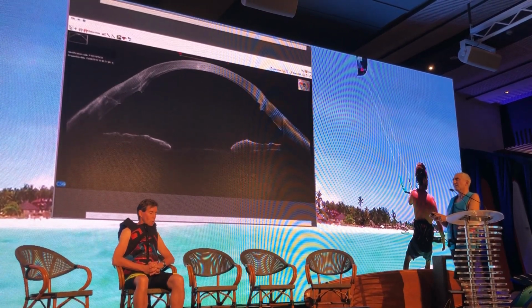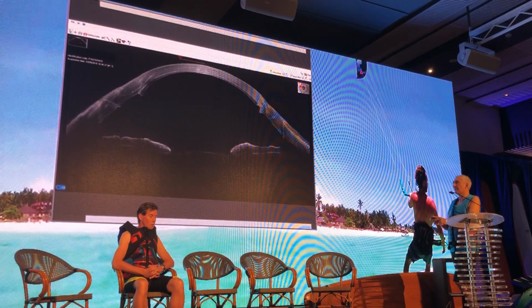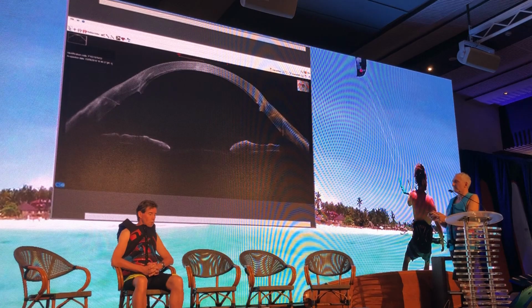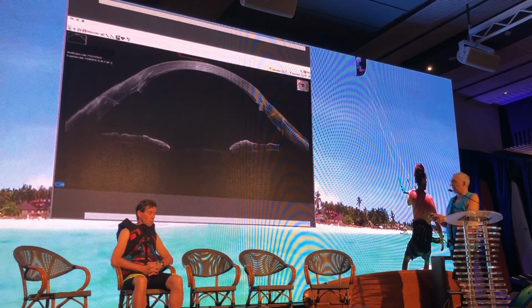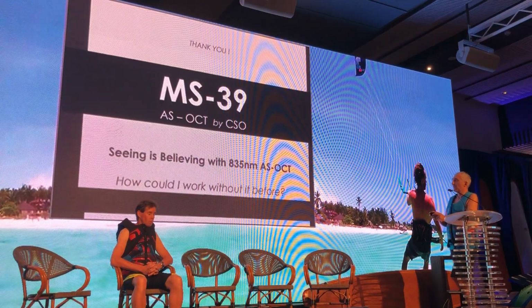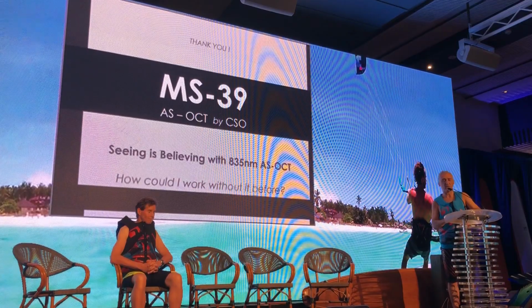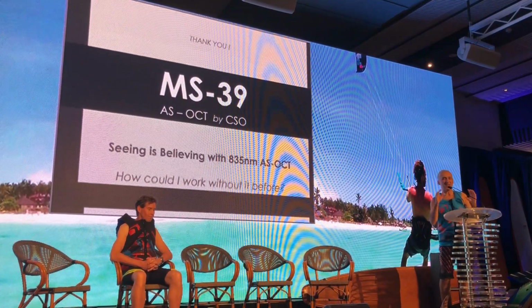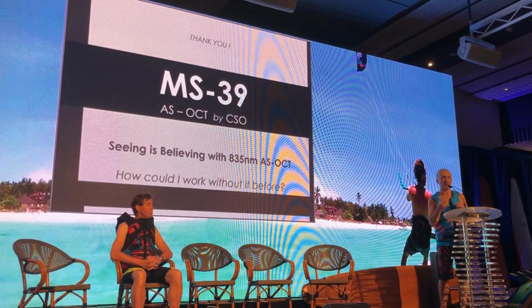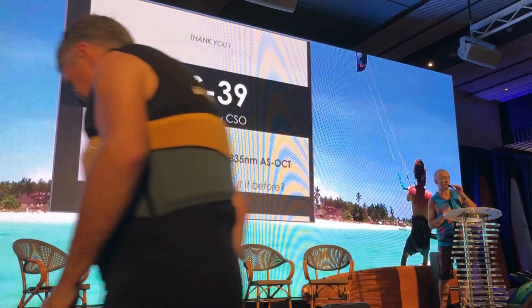It was very useful also in this case, having the possibility of knowing in advance exactly what was going on in the map of the epithelium on the stroma and so forth. Thank you very much for your attention.